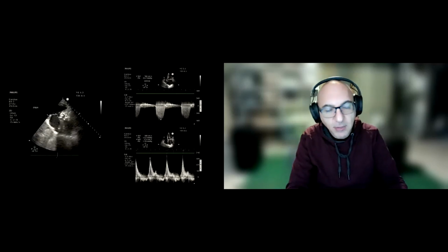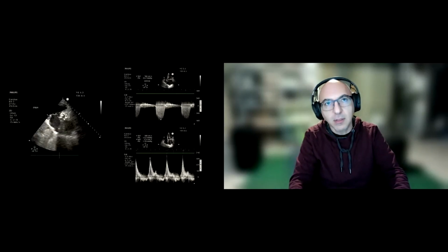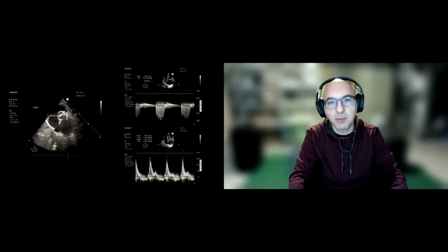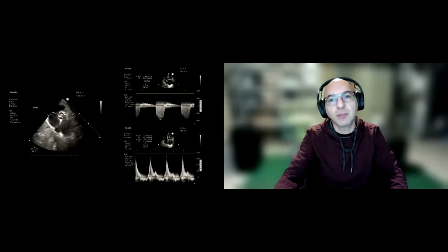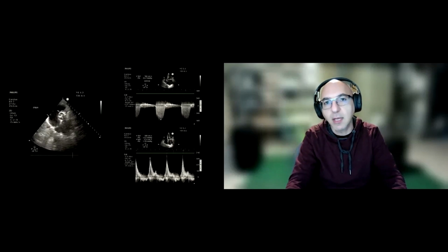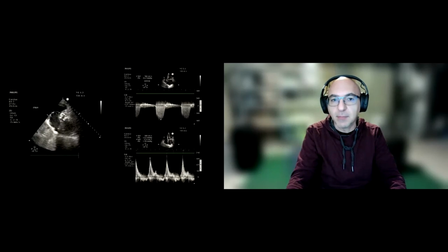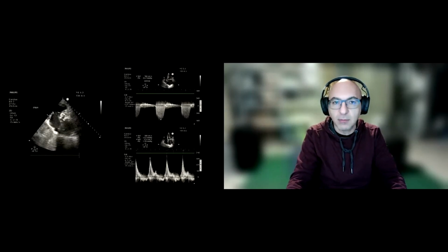So imagine someone who has normal lungs and you intubate them and you put them on a PEEP of 10. Forget inspiratory pressure for now, just the PEEP, which is continuous pressure. Some of that pressure is going to translate into transmural pressure on the heart and limit filling during diastole. If the lungs were normal, almost half of that pressure is going to have a transmural effect.